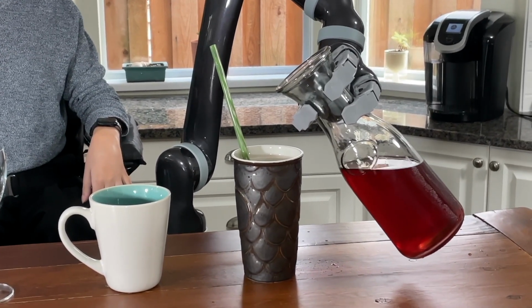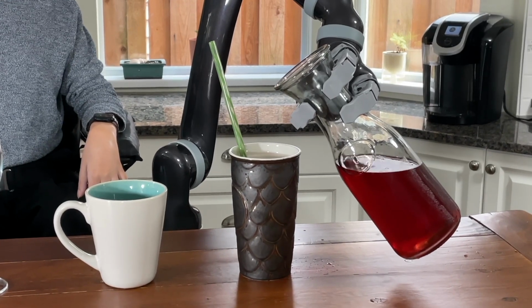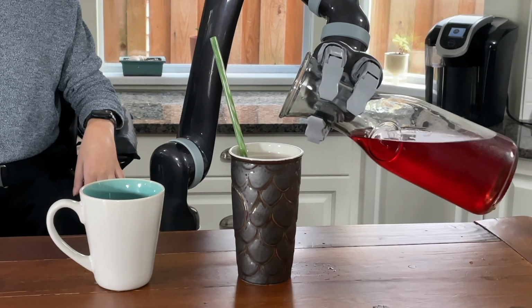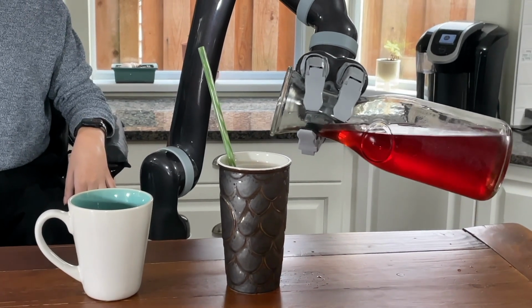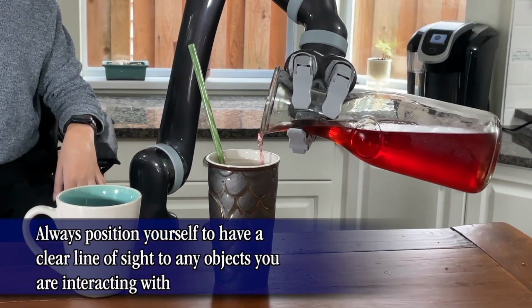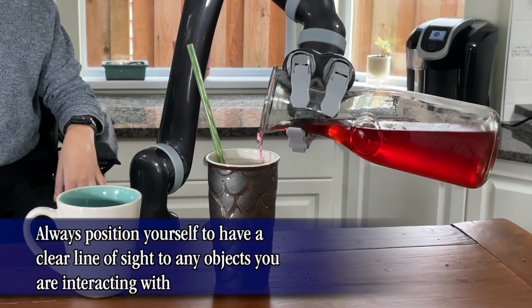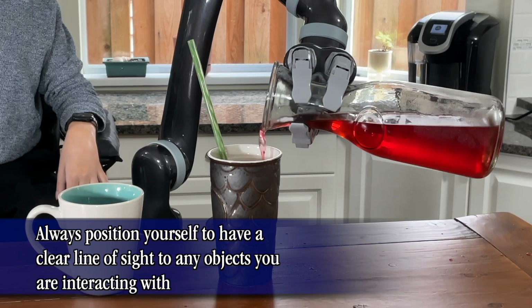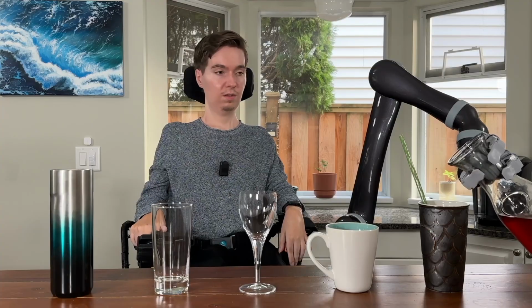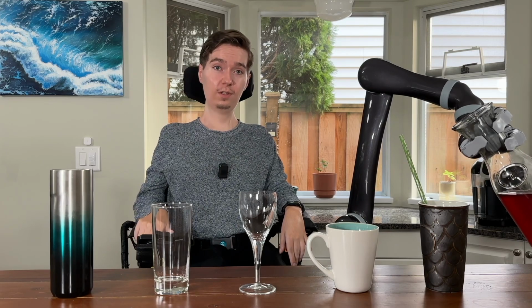So I'm back in B2, and I'm just rotating the wrist very slowly and keeping an eye on where it's going to be pouring. So this looks good, and we're pouring. So let's get a little bit in here. And we're going to rotate the wrist back. There. That was very successful, so let's fill up the rest of them now.